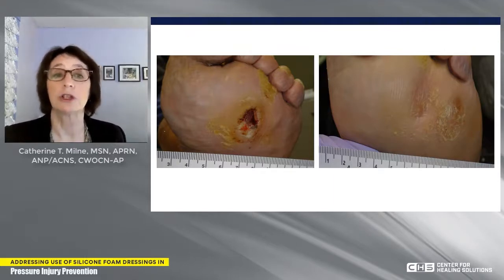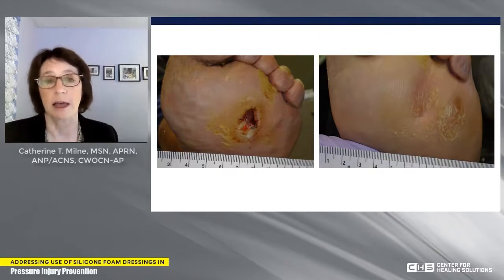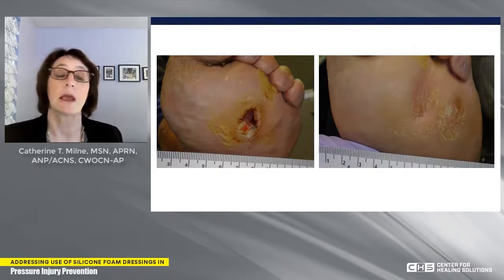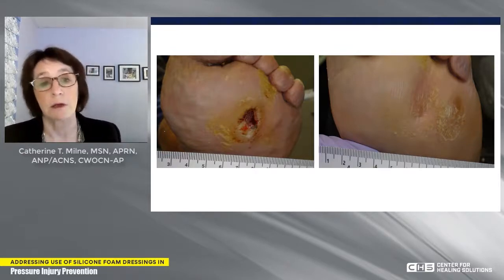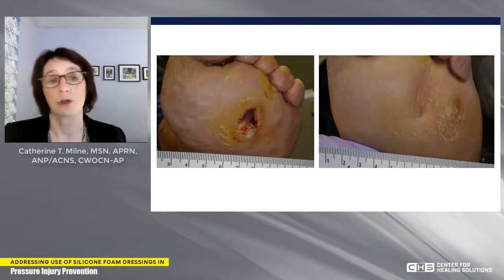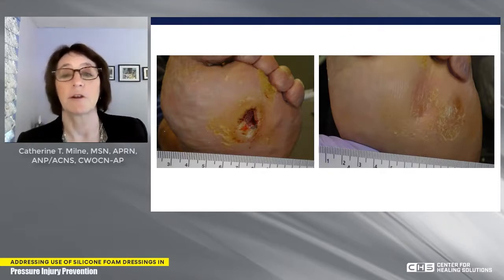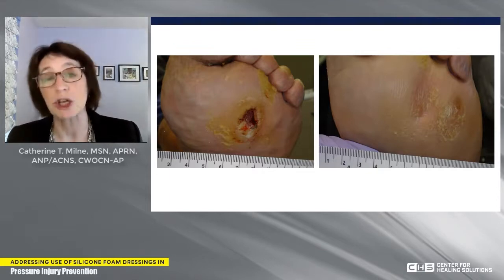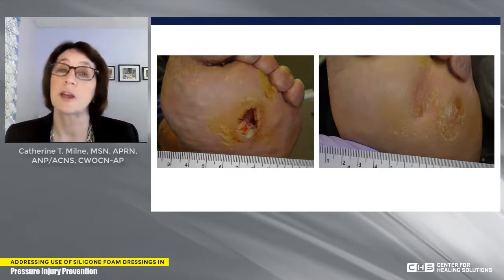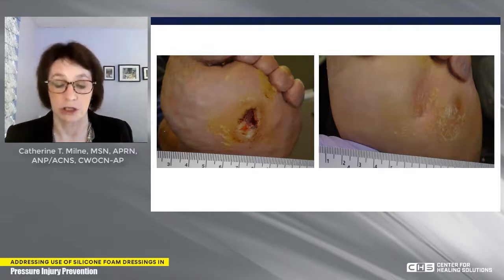Because of her stroke, and she was home and not positioning well and not cognizant of her position most of the time, because this was her side that had the hemiparesis, she frequently would put her foot down on the foot pedal. We made a number of adjustments with her seating, but again, we had to both treat the wound. But once we healed the wound, we used a multi-layer foam dressing to keep the wound from recurring because some of the issues couldn't be changed, including her ability to be cognizant of where her foot was, even though we made as many wheelchair adjustments as we could.